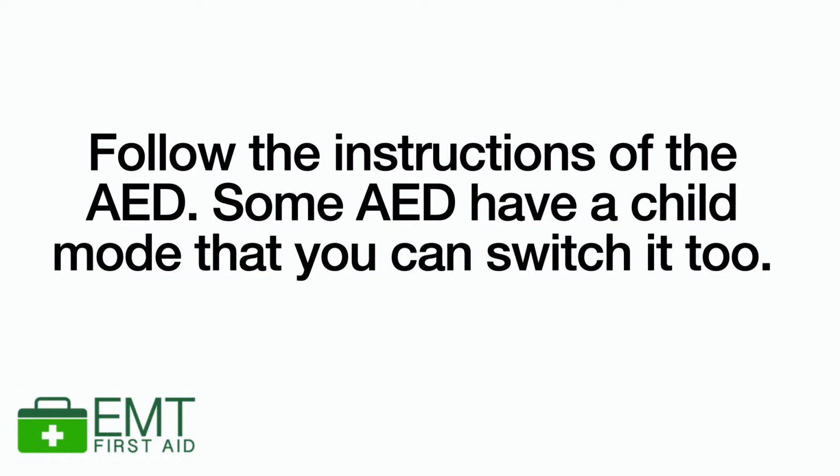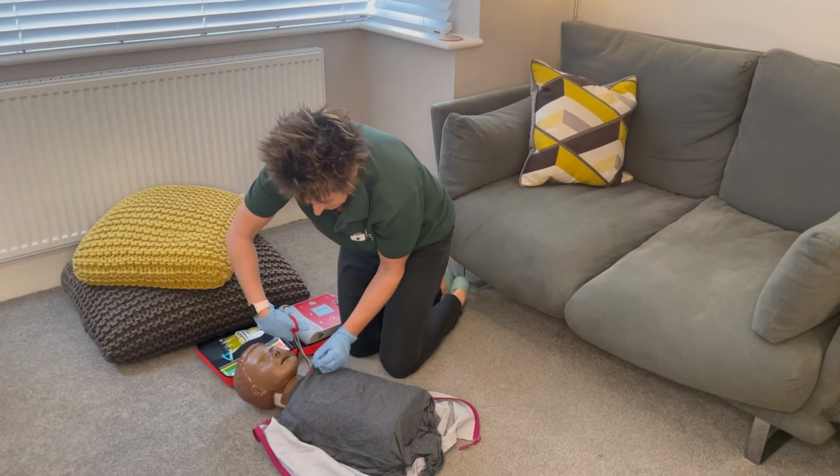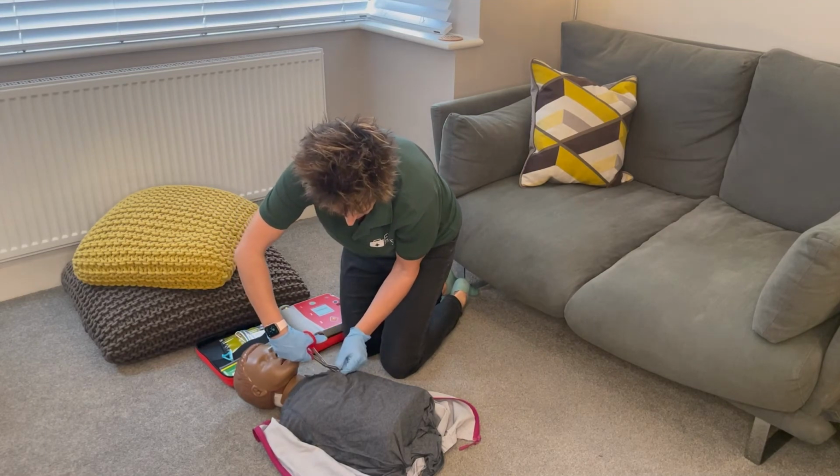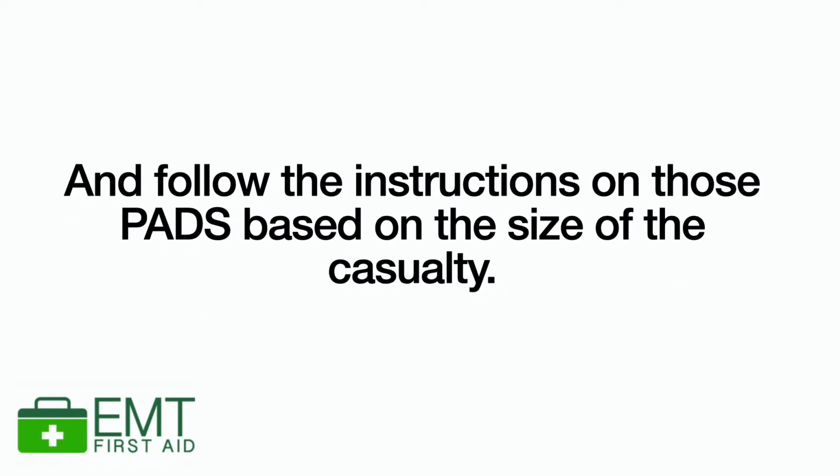I'm putting my gloves on, my PPE, and then I'm going to get the scissors and cut their t-shirt off so I've got a naked chest. I will then put the pads on. Now this is a bit that's different. On a child, we place the pads front and back.